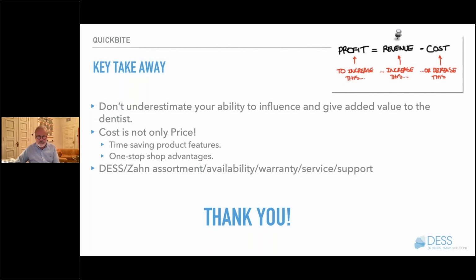The longer your angled base abutment is, the less you can angle the screw. It's as simple as that. So we try to make it as low as possible to make the angle as wide as possible and give the dentist, or the lab, more flexibility in angling the screw.